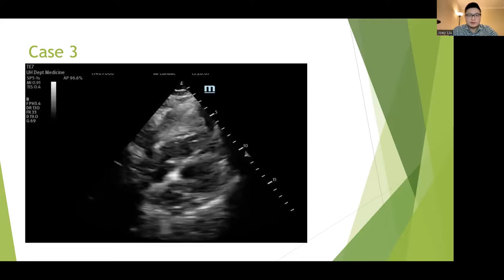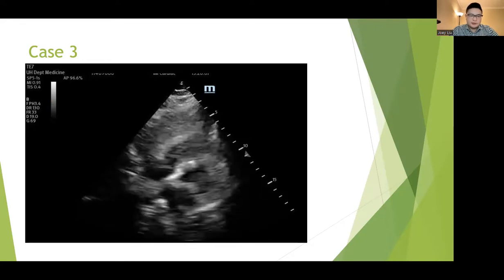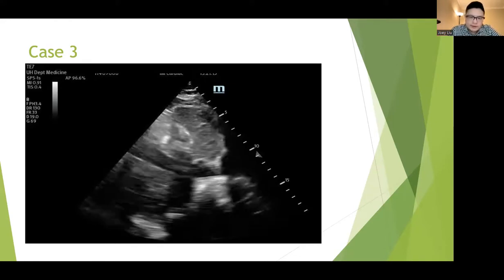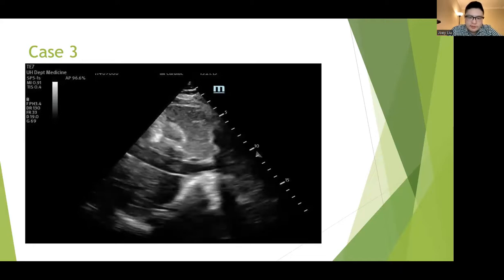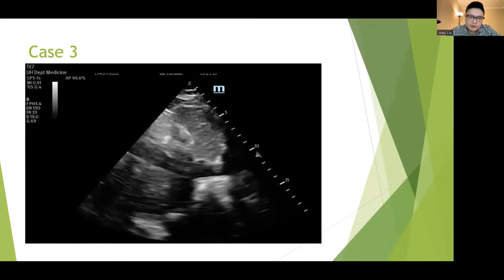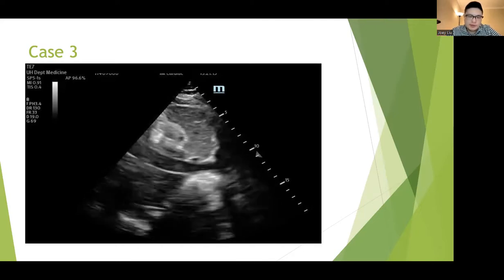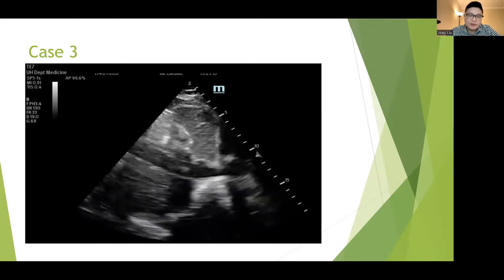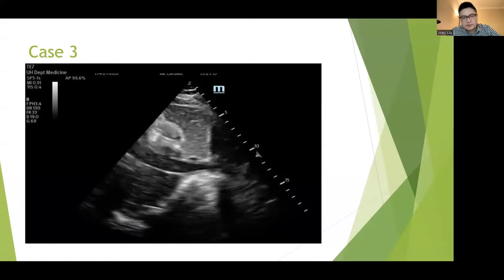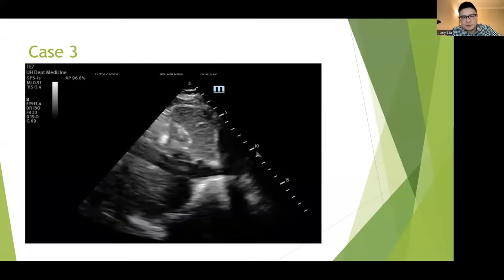Moving into the subcostal view, again, a little bit off axis here for sure. And using this view is where I went into the IVC view. So if you just look at the visual assessment of the IVC, you can say, okay, maybe closer to the IVC right atrium junction, there seems to be some collapsibility there. And if we were to take the traditional measurements just beside the hepatic vein, we could maybe demonstrate more than 50% collapsibility. However, if you look distal to that, further down inferiorly in the IVC, you can see that there doesn't seem to be quite as much collapsibility.